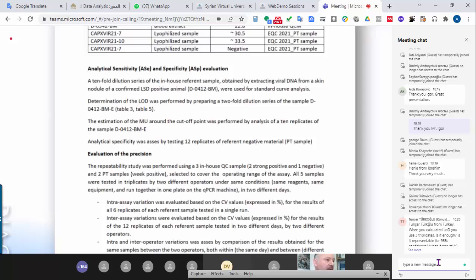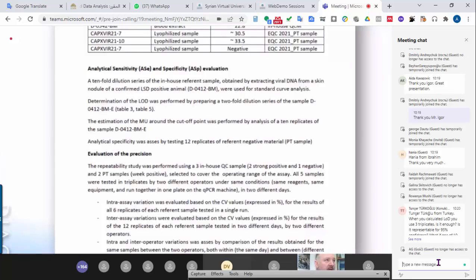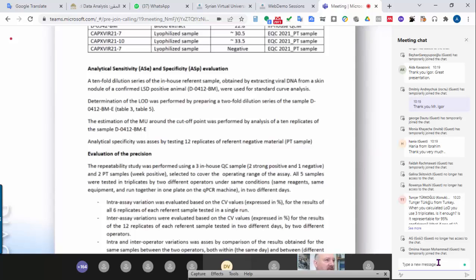Of course, if you would like to verify or implement some assay for a disease you don't have in your country, or you don't know if you have the disease, and you don't have any clinical specimens or other material from the disease in your possession, you must obtain external quality controls somehow, either from proficiency testing or from a reference center, maybe the reference laboratory or some international OIE reference laboratory, for example.